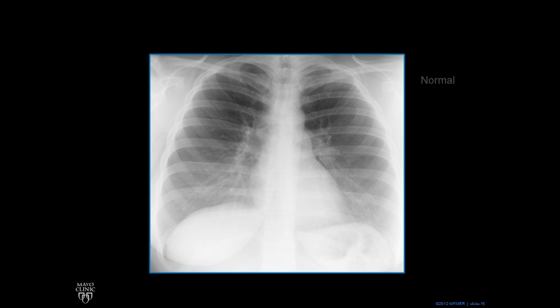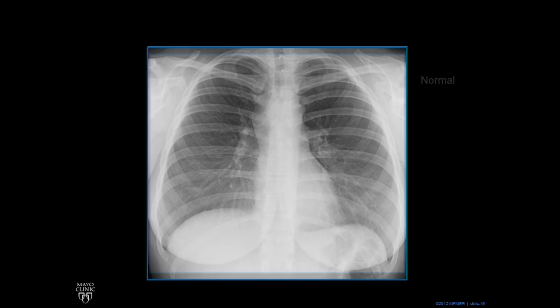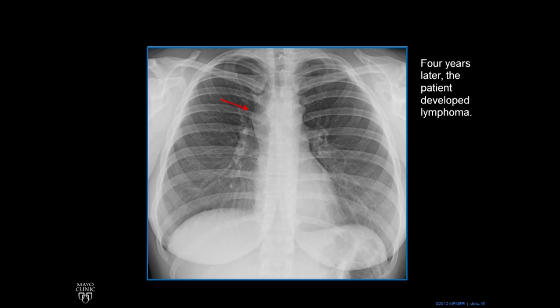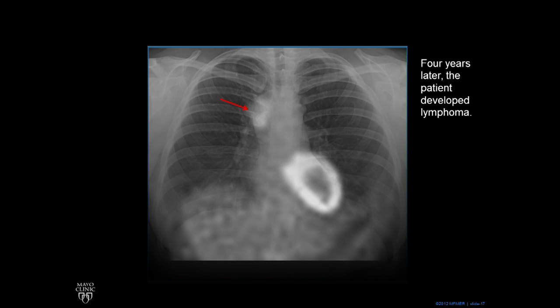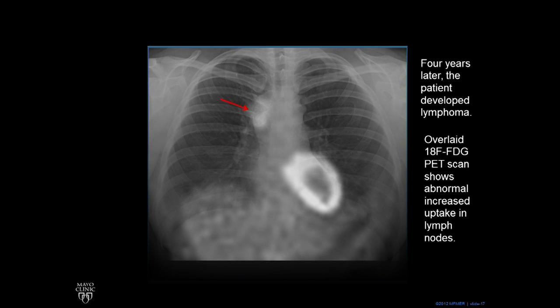This is a normal chest x-ray. However, four years later, this patient developed lymphoma. In the region of the SVC, there's an abnormal contour — there's too much soft tissue, as you can see with the red arrow. We overlay an 18-FDG PET scan, which goes to areas of increased metabolism. That mass is lighting up because it's using more glucose than usual — it's a lymphoma. The left ventricle lights up because that's normal. You can see increased uptake in the lymph node region; that abnormal contour is a mass.